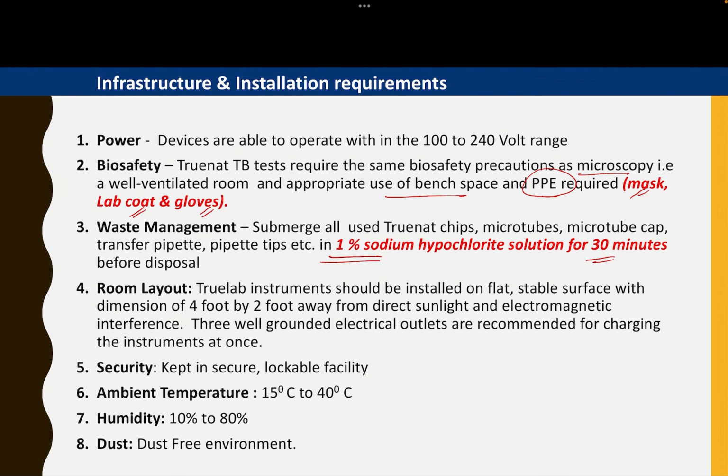So you get a concentrated solution. From that, you have to dilute and make a 1% sodium hypochlorite solution. And it has to be prepared freshly every day because slowly it will disintegrate, and by the next day, this will be only water. Okay, so you won't have any use. So this has to be prepared freshly every day.